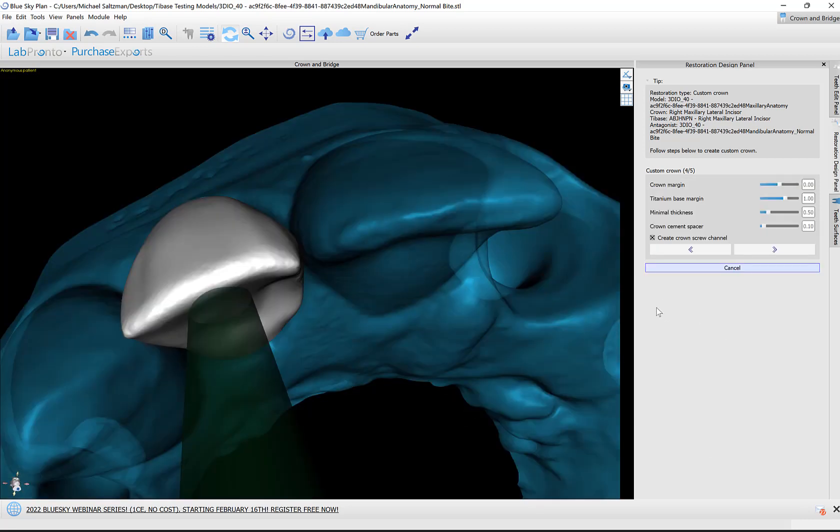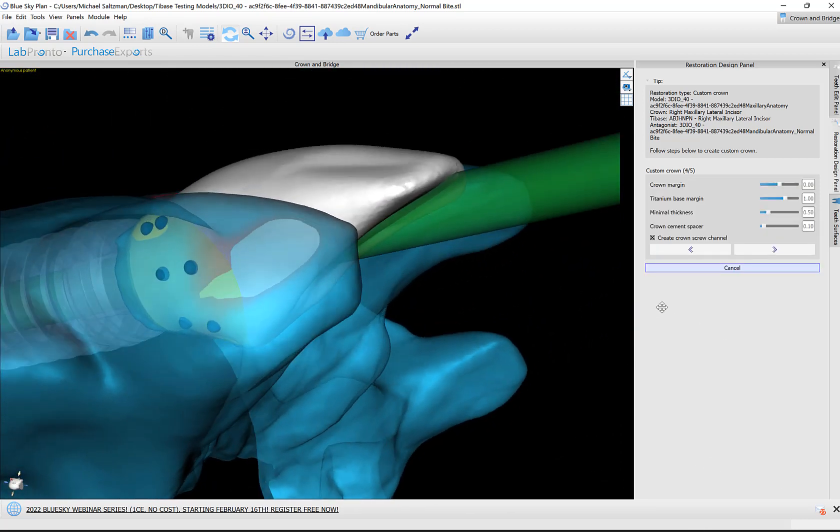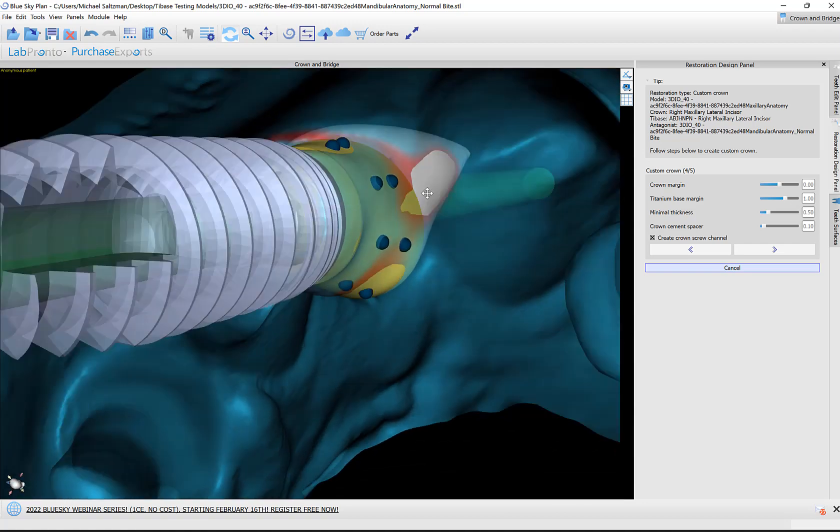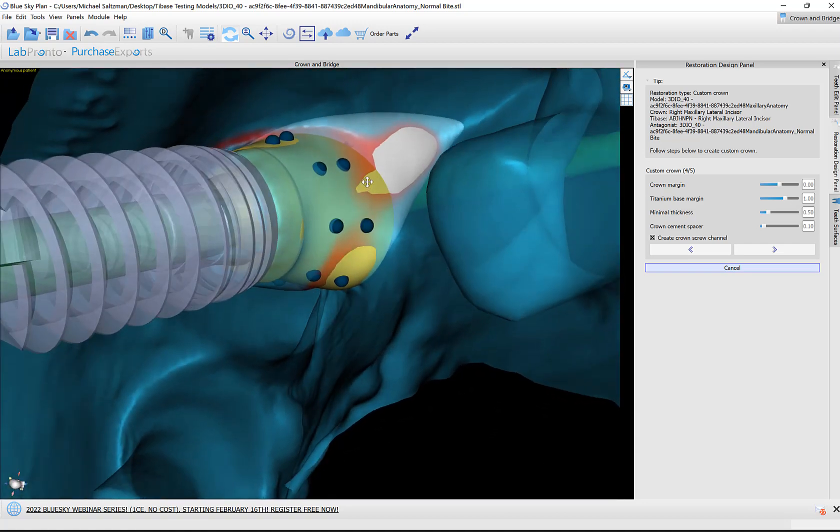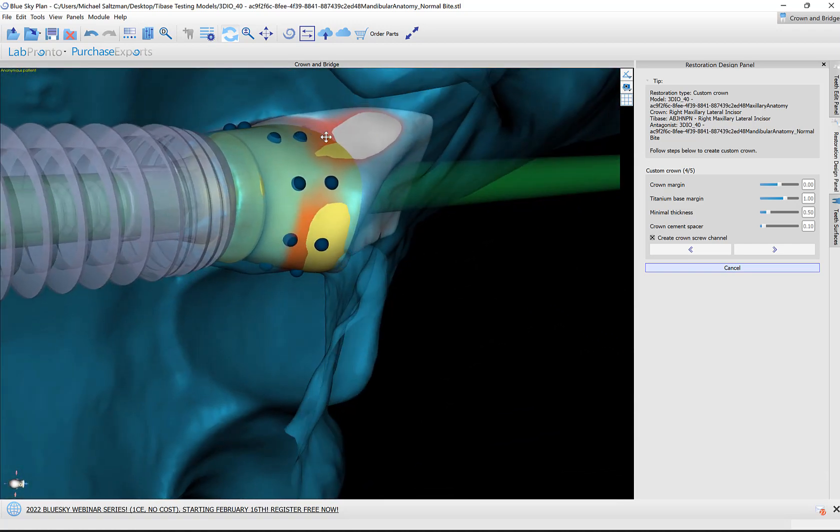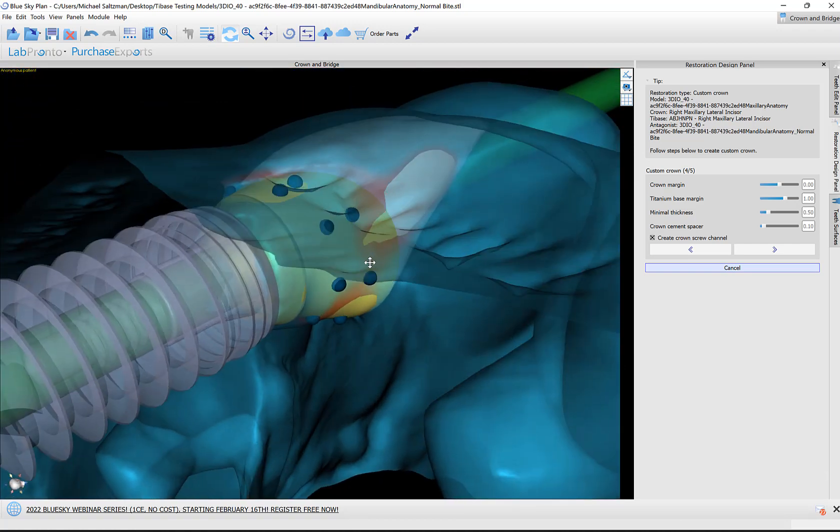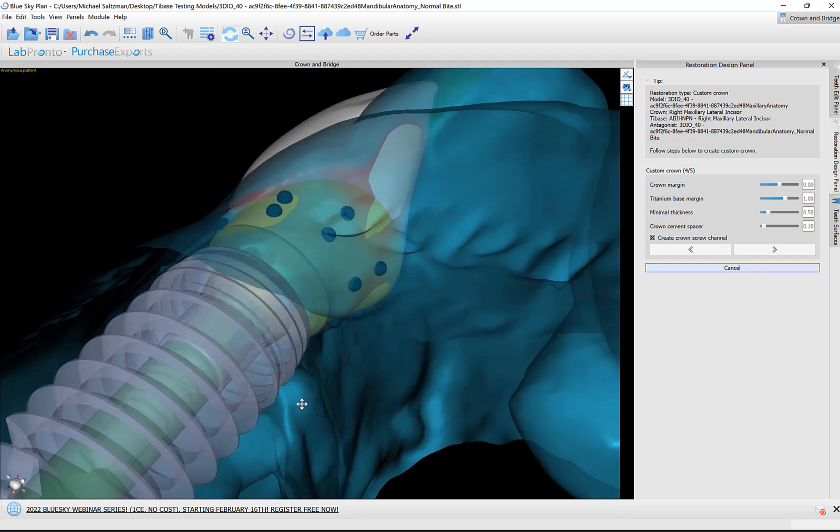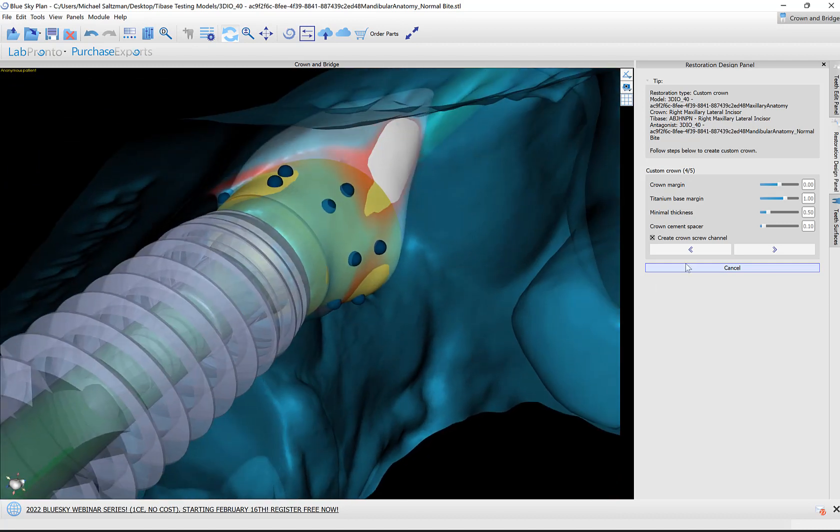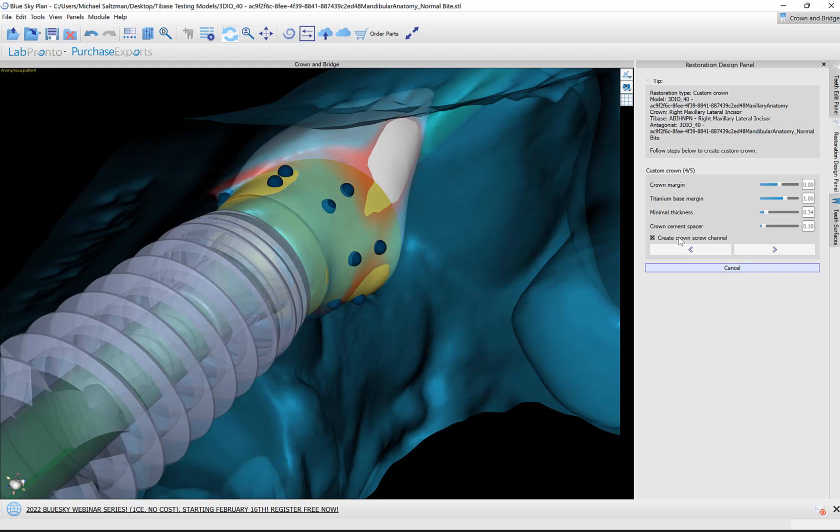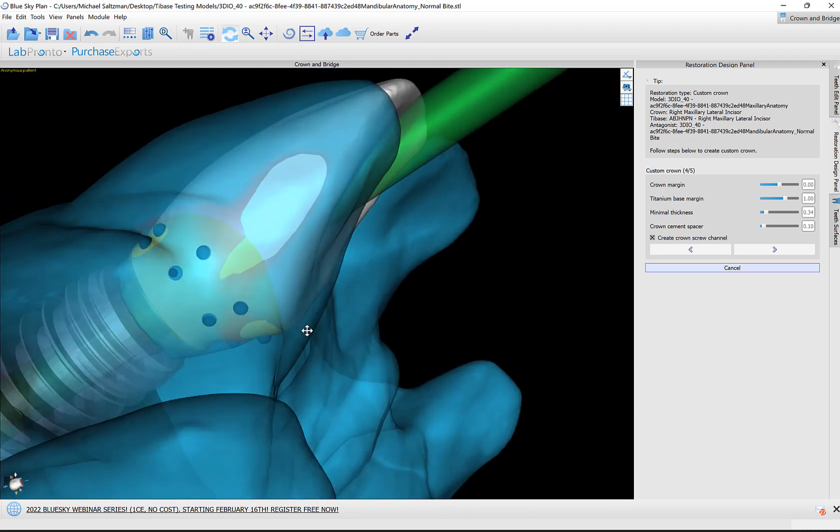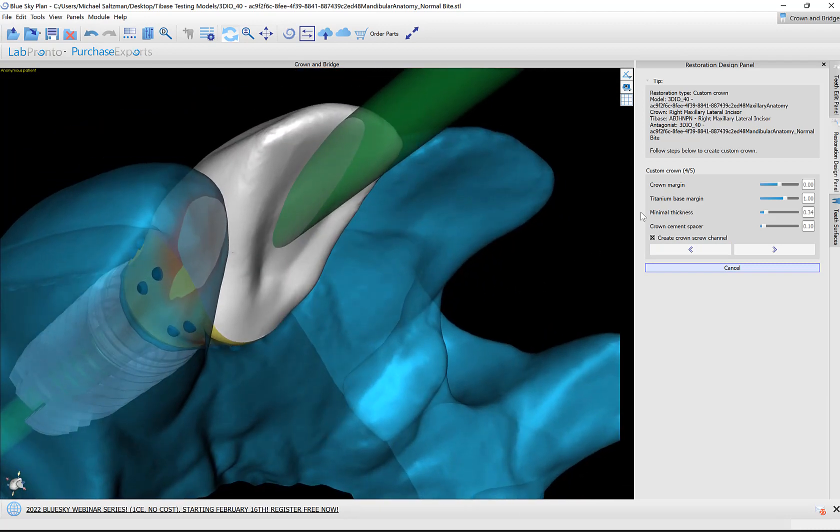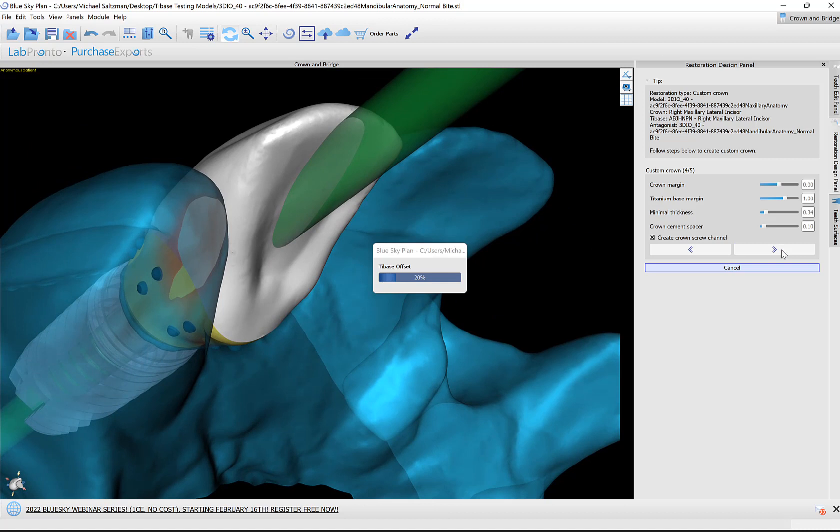What we're going to do now is modify if needed or just approve the connection between the crown and the titanium base. We could grab and drag any of these nodes in any direction. We could also use the sliders that we have here to modify the connection, the contour, minimal thickness, and whatever other settings that we would like. If we like to create a screw channel, then make sure the 'create crown screw channel' box is selected. I'm going to click on Next.